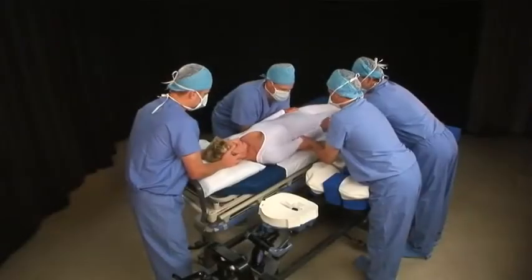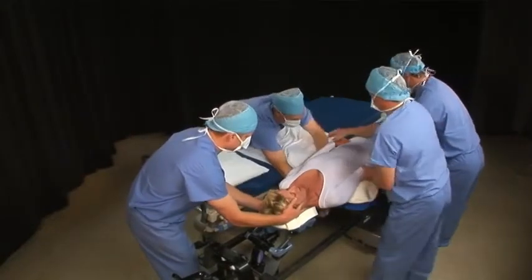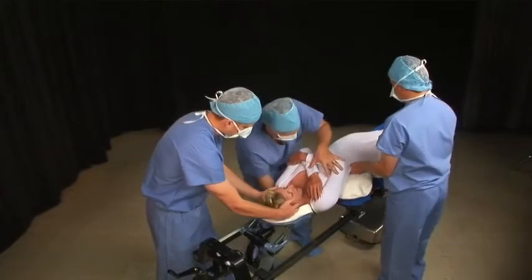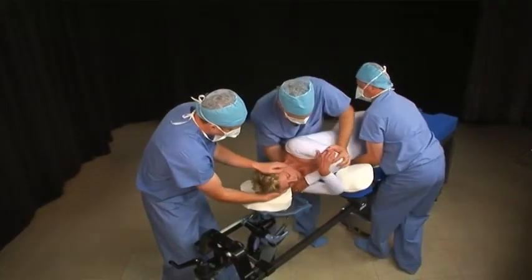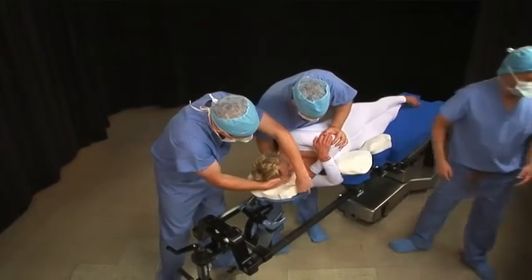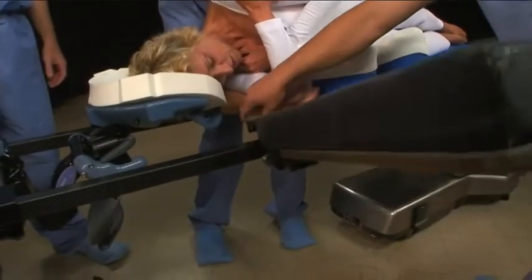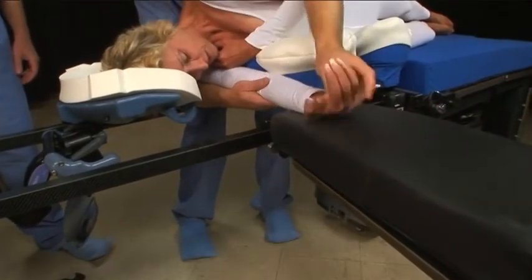When positioning laterally, first transfer the patient supine onto the frame. Remove the stretcher. Cross the patient's arms over her chest. Reach under the shoulders and hug the patient from behind as you lift and rotate. Be sure to cup the patient's lower elbow so that it will not get bumped during the turn. Attach a standard arm board to the frame. Still protecting the elbow, rest the patient's lower arm on the arm board.